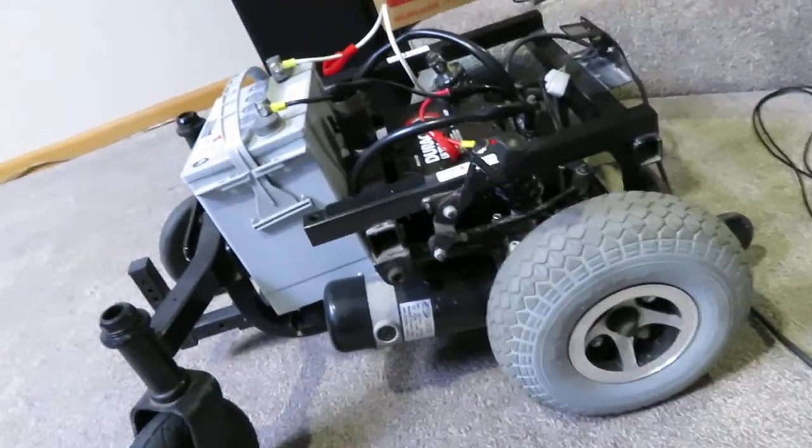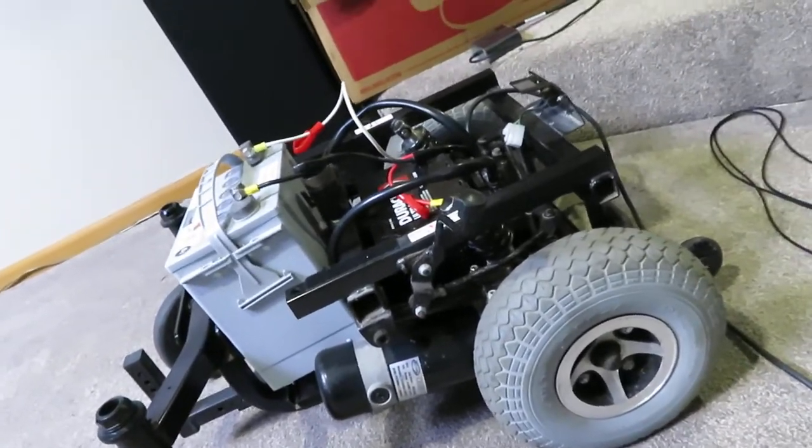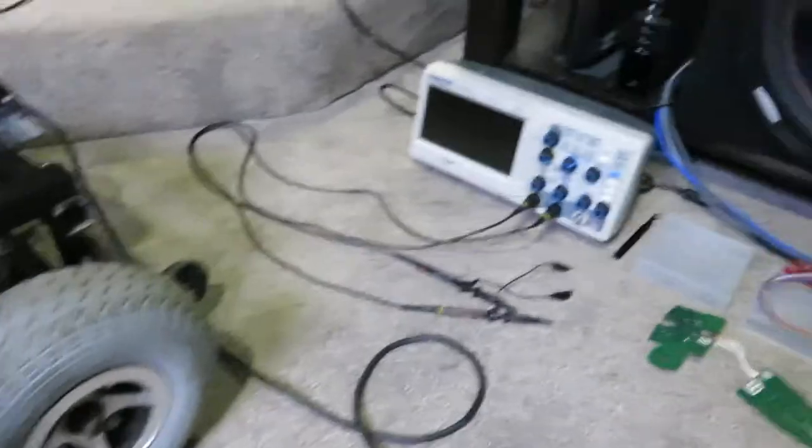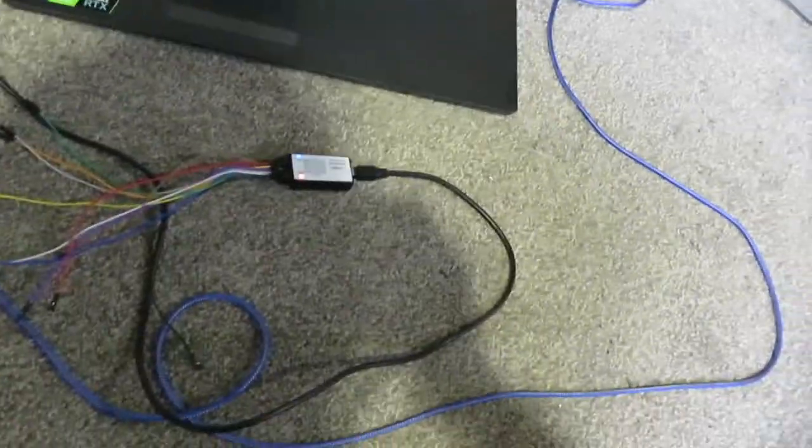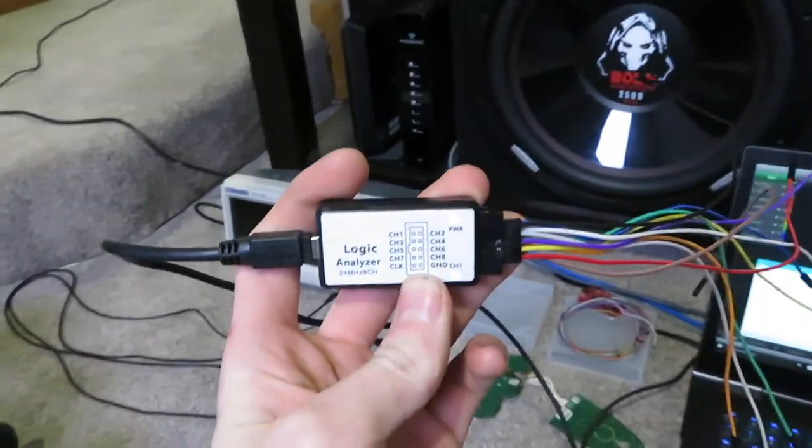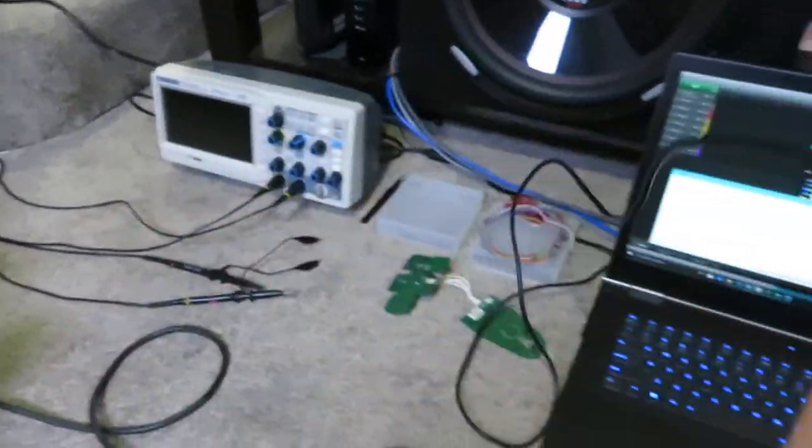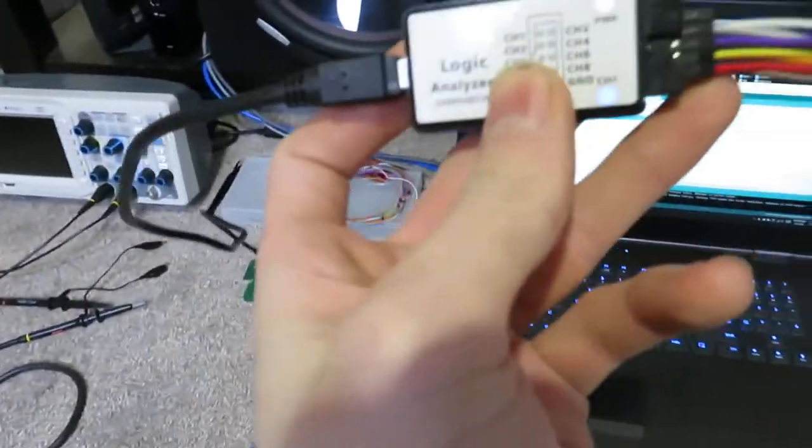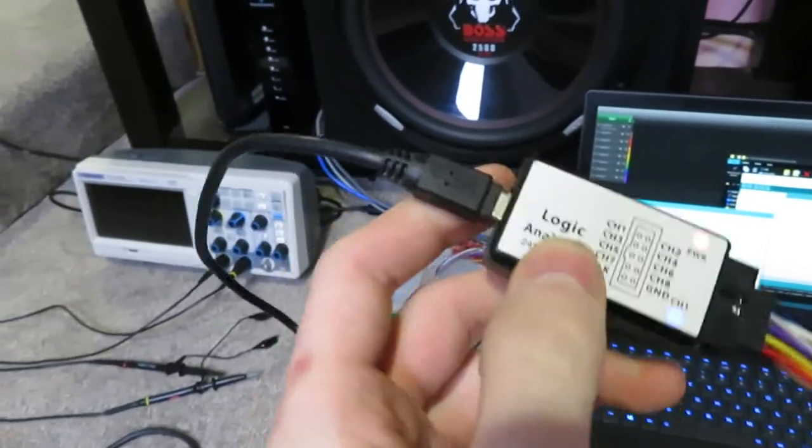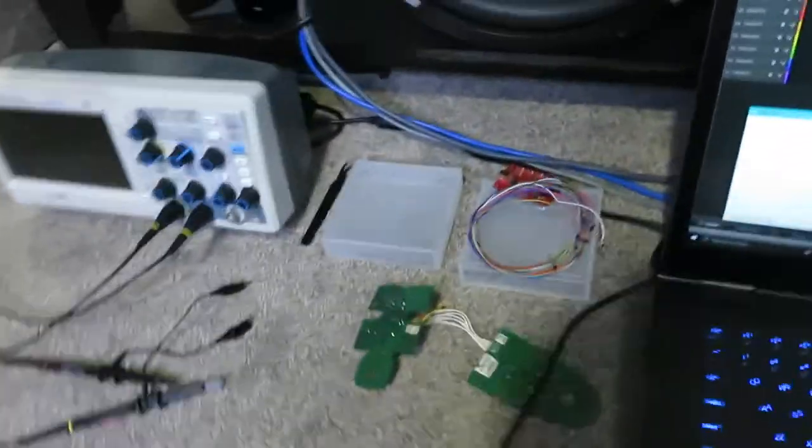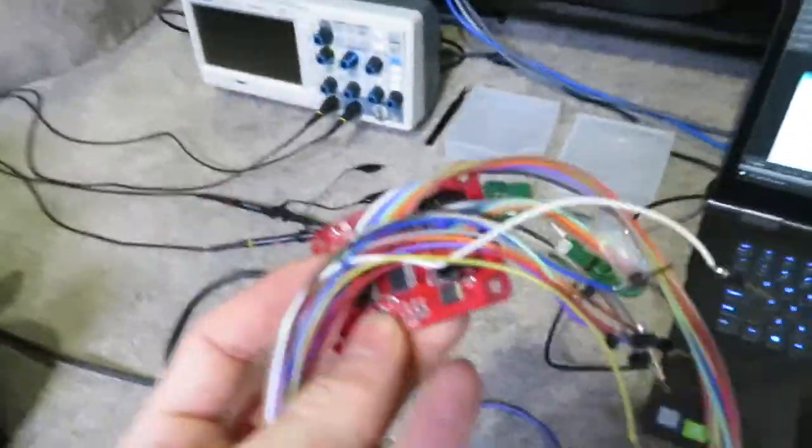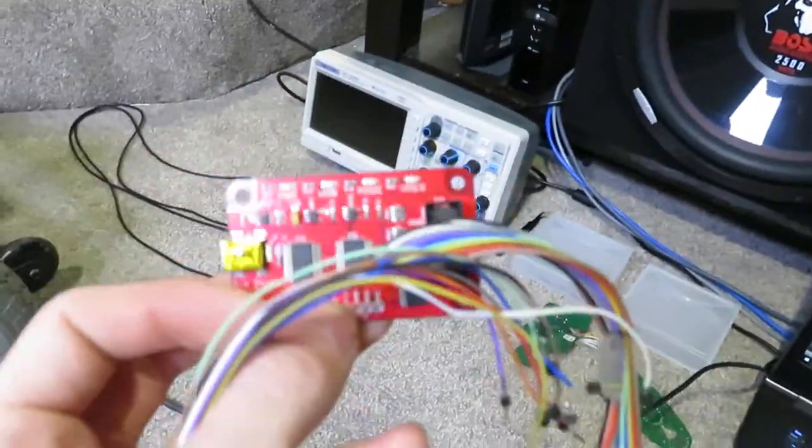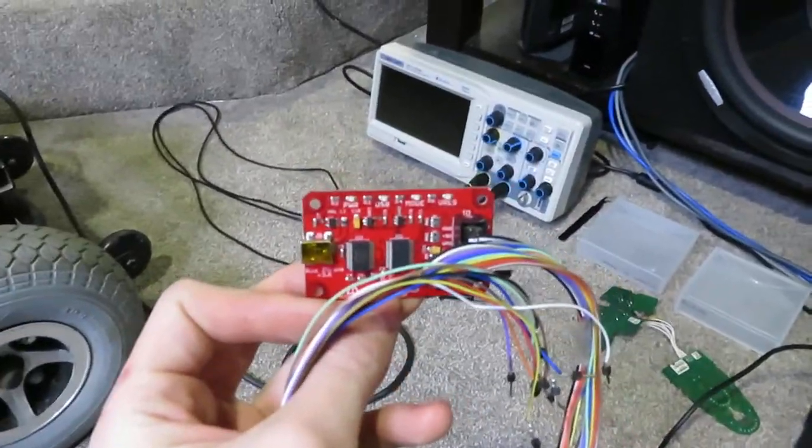But I used my oscilloscope basically to figure that out, and also this logic analyzer I got off eBay for 11 bucks. It's actually a pretty good one - you should check it out if you don't have one. You could probably also use a bus pirate. I didn't use mine for this, but I imagine it would do about the same thing.